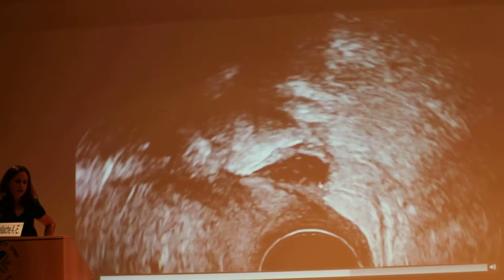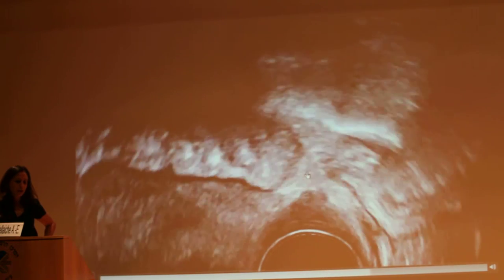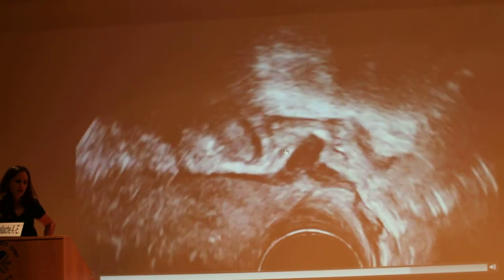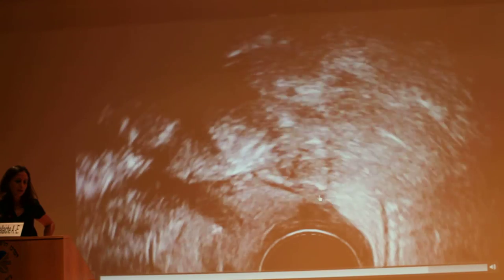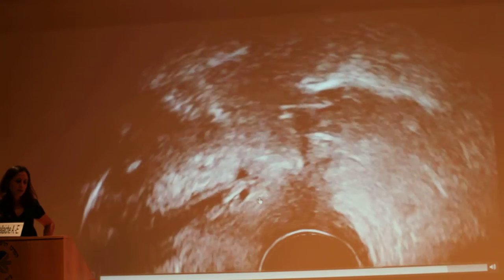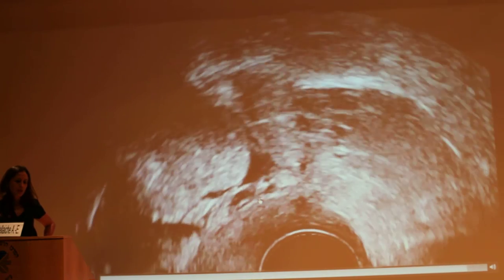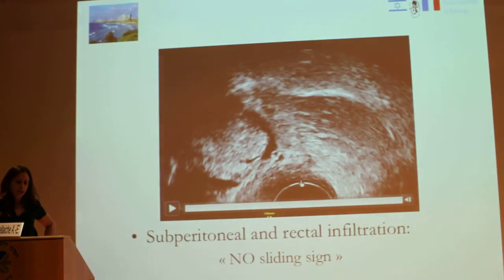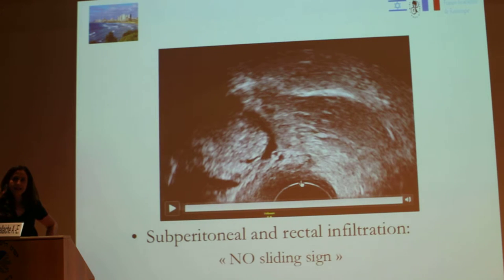It is important to recognize the adhesions just behind the uterus. Here you have a digestive location where the rectum and the uterus are stuck together and there is no sliding sign.